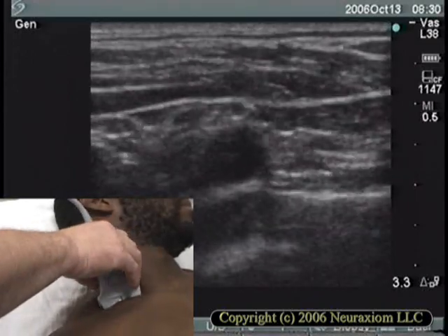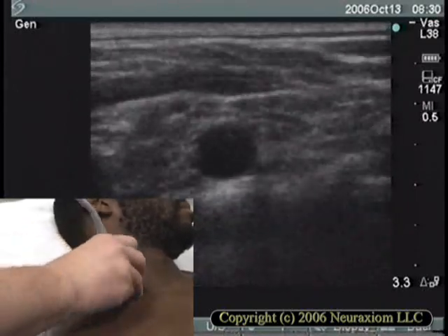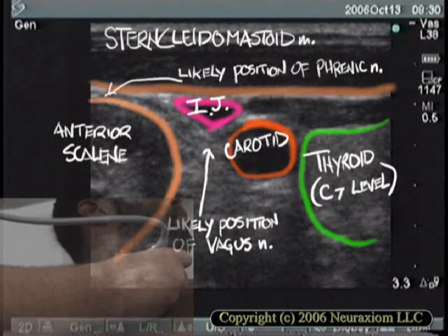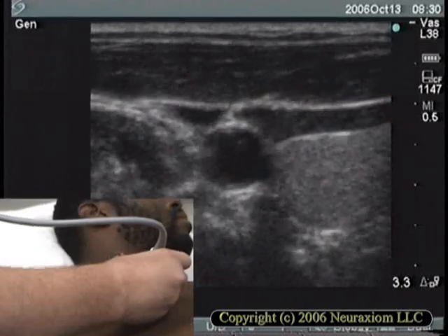In this demonstration, we'll now move the probe anteriorly and identify some of the structures in the front of the neck. There — we did it. Take a good look at the structures and we'll get back to the interesting part with the brachial plexus.